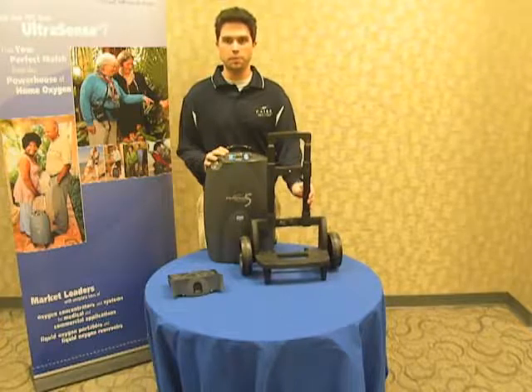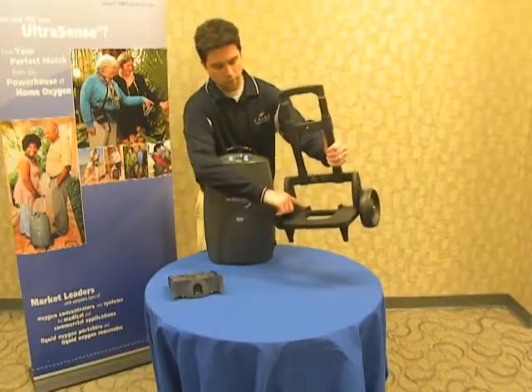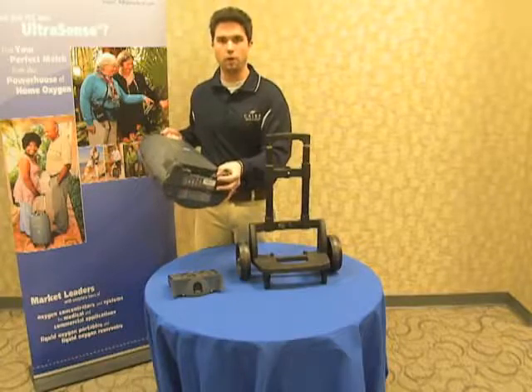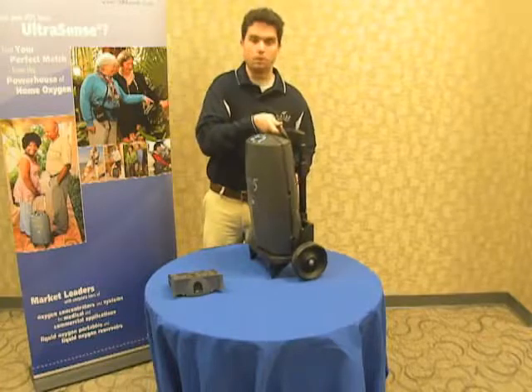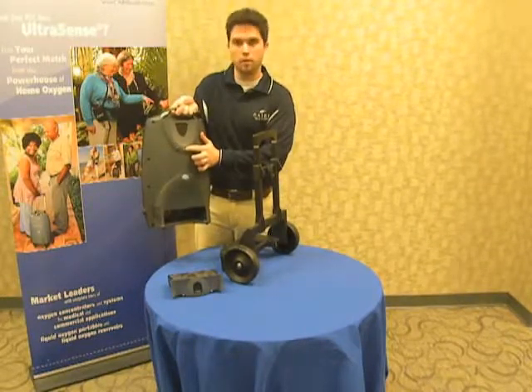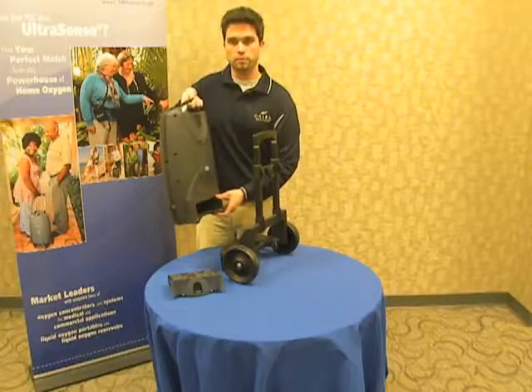Alright, now that we have our cart assembled, let's install the Eclipse onto the cart and also install the battery into the back of the unit. Note on the cart here that there are two tabs on the back. There are some slots or holes on the bottom of the Eclipse that those will line up with in order to secure it on the cart in the proper alignment. So once you align it properly on there, note that there is a turn knob on the back that fits into this hole on the back of the Eclipse. These also need to be aligned. Once you have everything aligned properly, screw the knob in place to assemble the Eclipse to the cart.